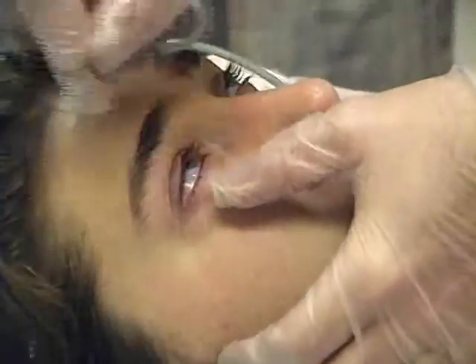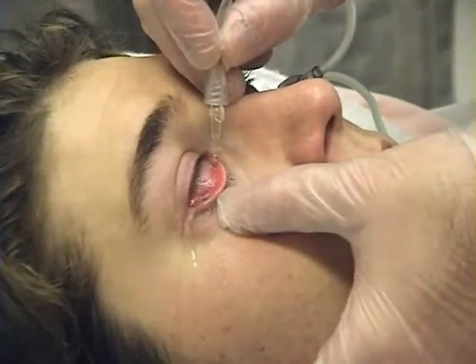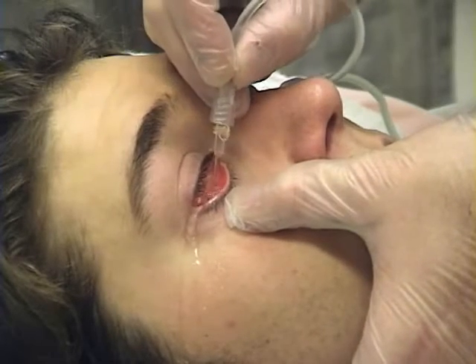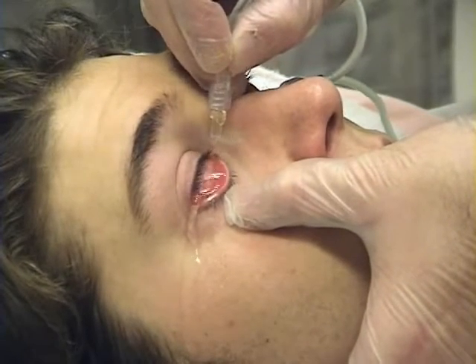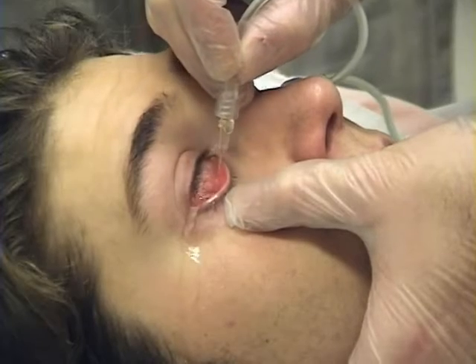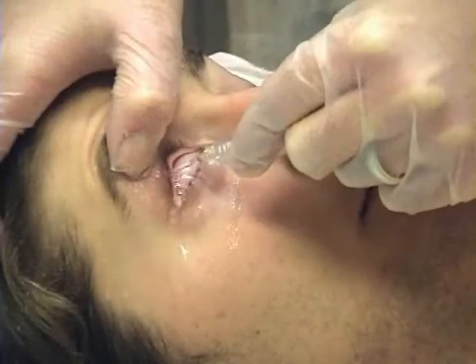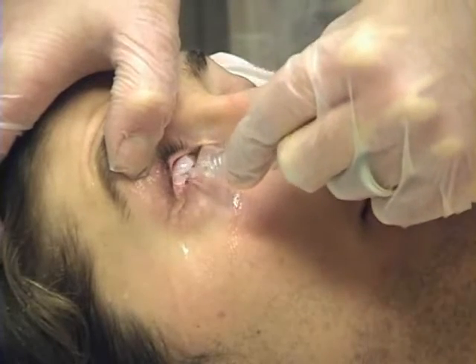Open the wheel clamp on the intravenous tubing and begin to irrigate the eye. Hold the tubing several centimeters above the eye. Direct the flow to all portions of the eye, including both the inferior and superior fornices and the cornea.